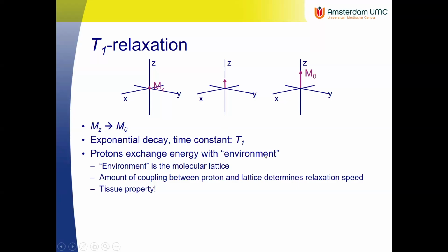During the RF excitation, I load them with energy, they absorb the energy, and during the relaxation process, they interchange that energy back with the environment. The environment is the molecules around the water, and the amount of coupling between the protons and the environment determines the relaxation speed. So it is a tissue property, because the speed of relaxation, the amount of energy exchanged and at what speed, is determined by the chemical environment.